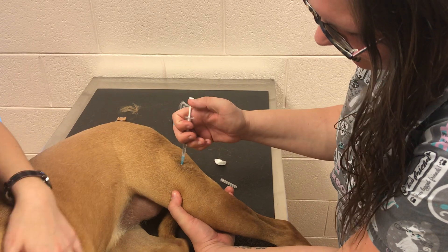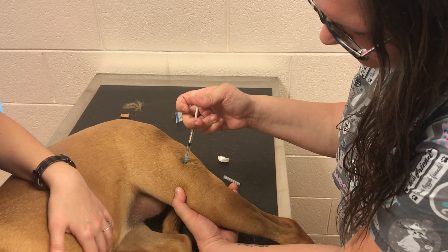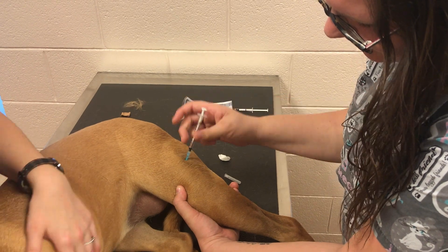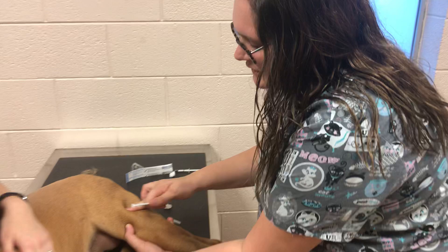Insert. Pull back on the syringe to make sure we're not in a vessel, and go ahead and inject. Pull out and rub the area to make sure the medication goes into some of the vessels.